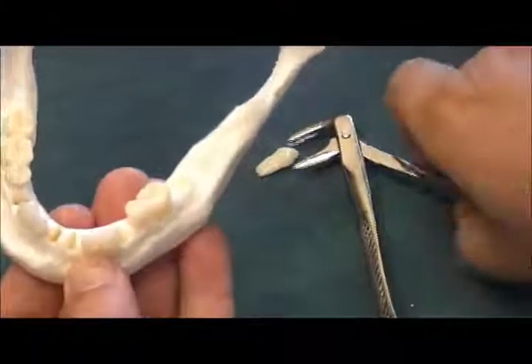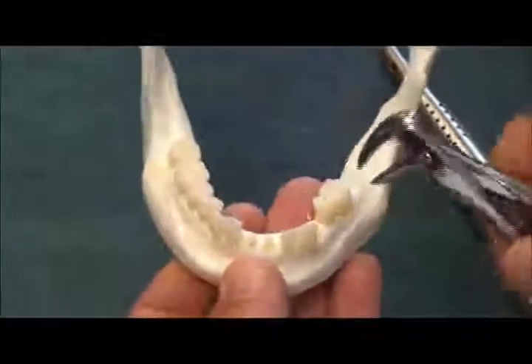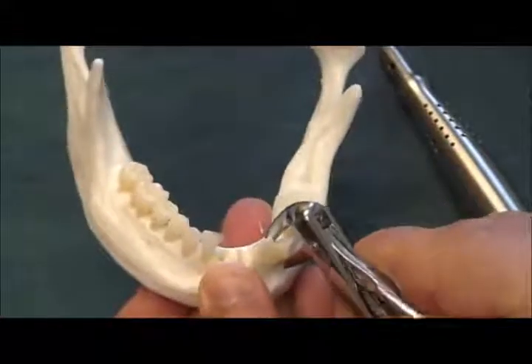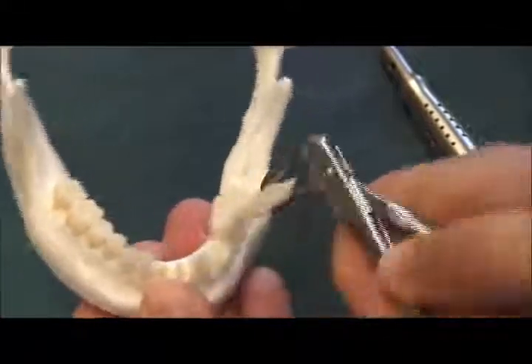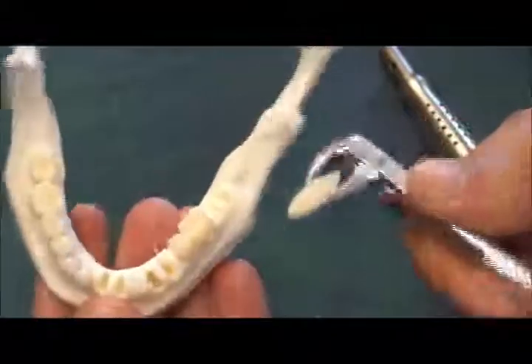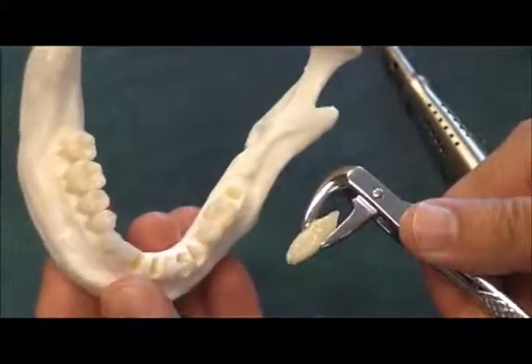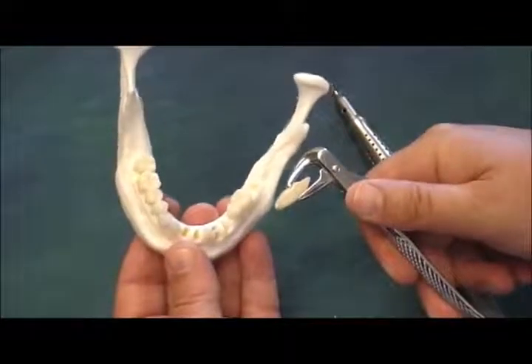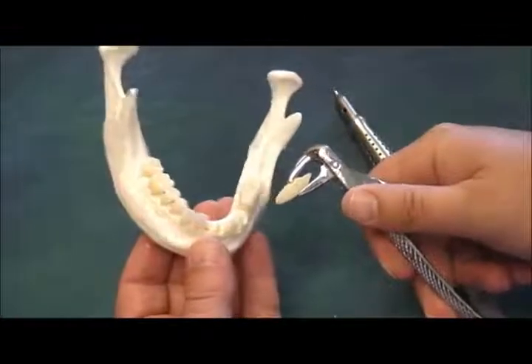Then I'm just going to apply the forceps to the tooth and basically use right and left rotation to the buccal, and the tooth just loosens up and comes out. And again, this is pretty true to form as to what it looks like in the mouth and what it feels like. So I think those points will be helpful for you.